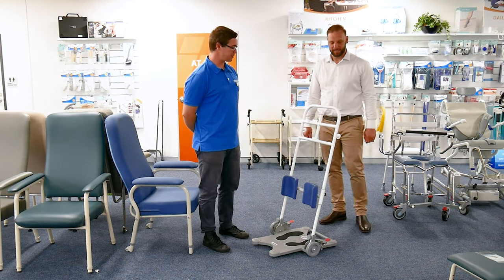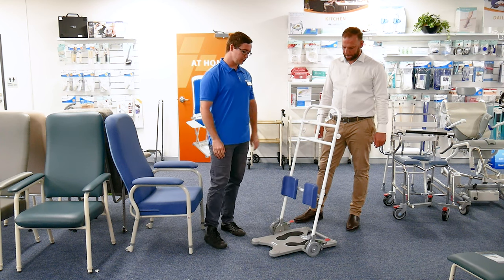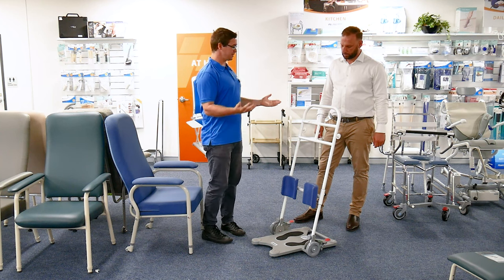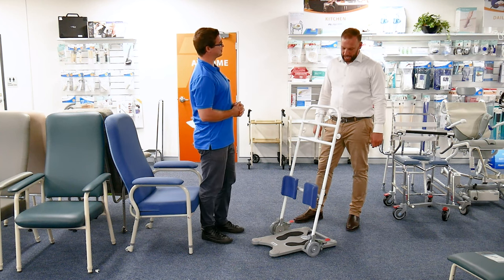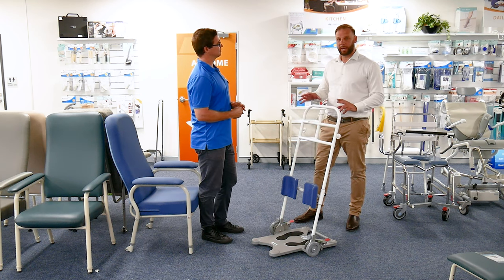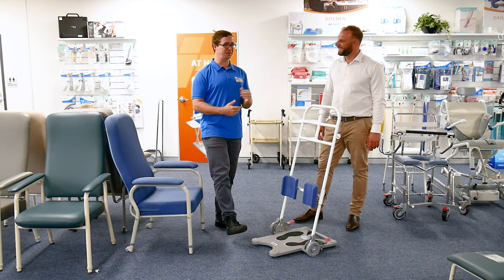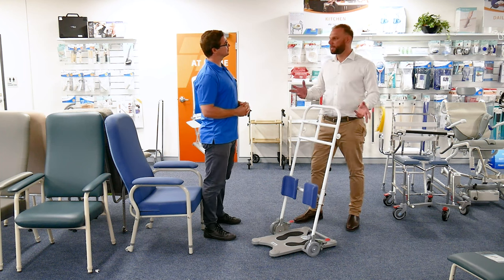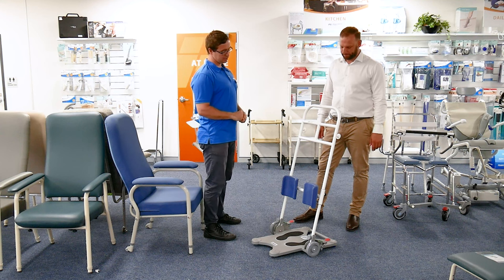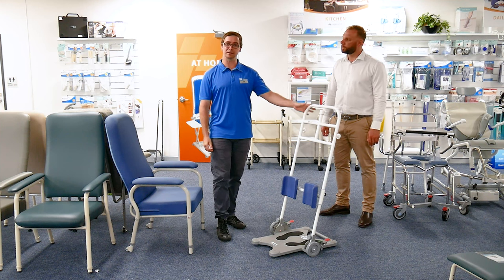We're at ILS at Warners Bay with Anton today, looking at a range of equipment. Today we're looking at what we would call a patient transfer device — or what some people call a return. The Romedic is another brand that does a very similar thing. Sometimes people call equipment by one of the most popular brand names, like pivot. This one is called the Drive and Be Turn.